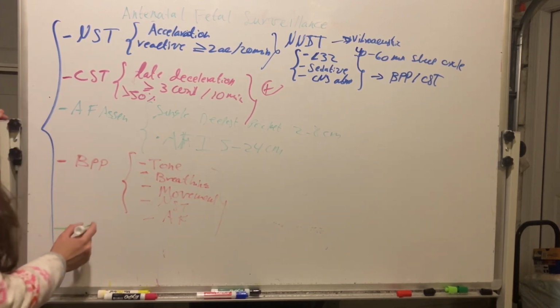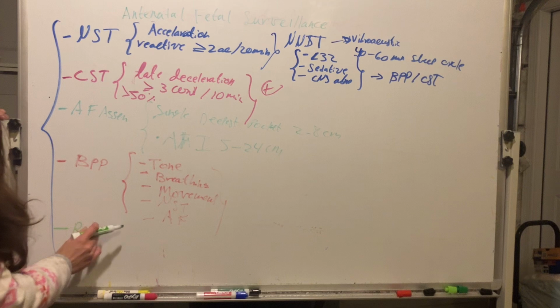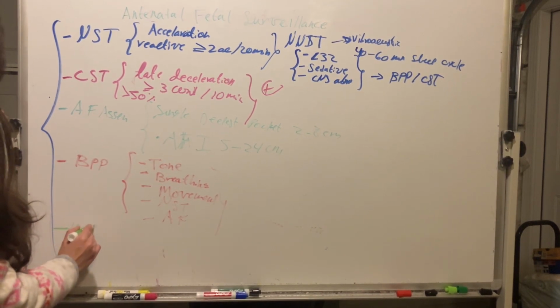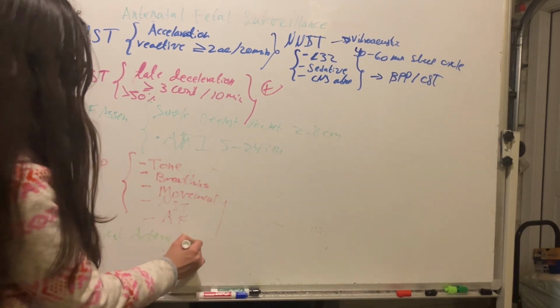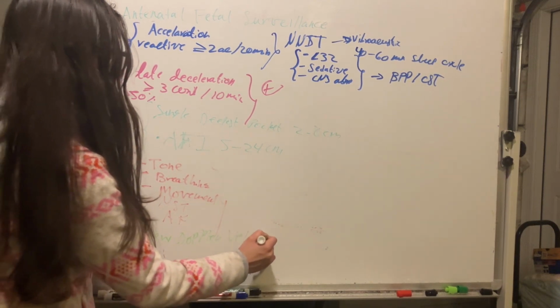And the other thing we do for evaluation is the umbilical artery Doppler velocimetry.